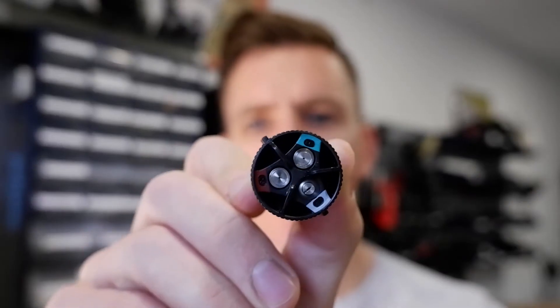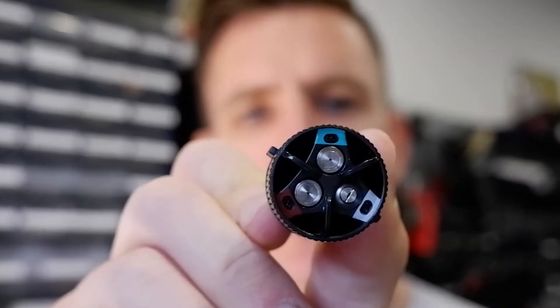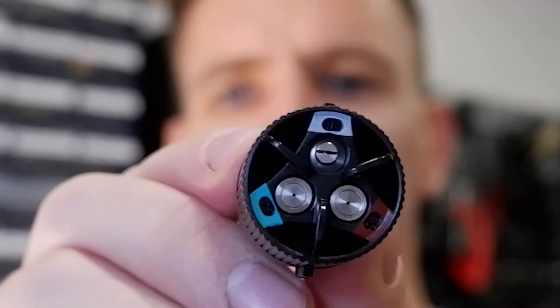Move it around and you get the green, and that is 80 microns — slightly bigger but not the biggest — and that also gives a cone spraying pattern.